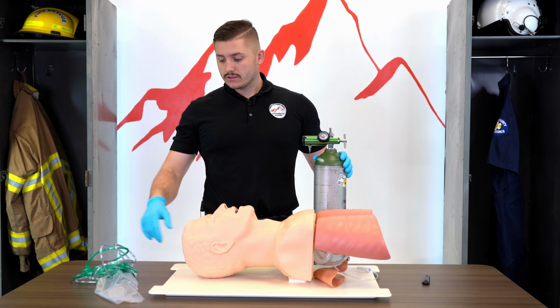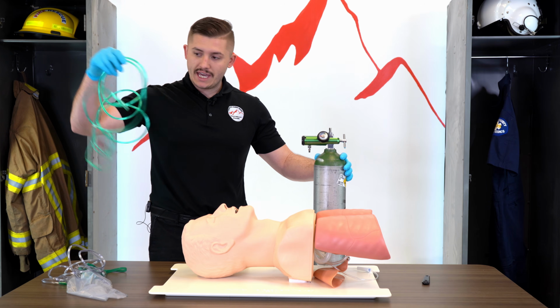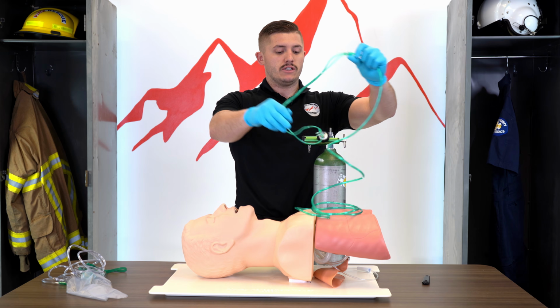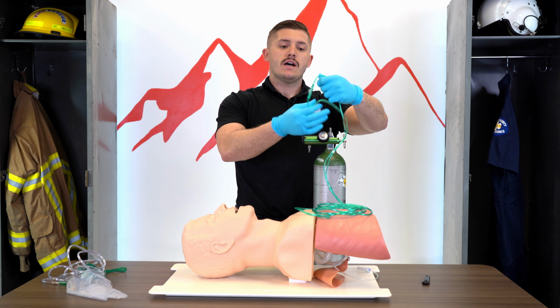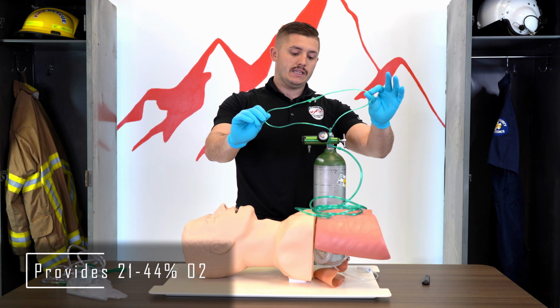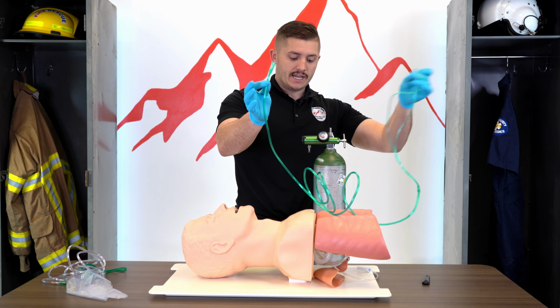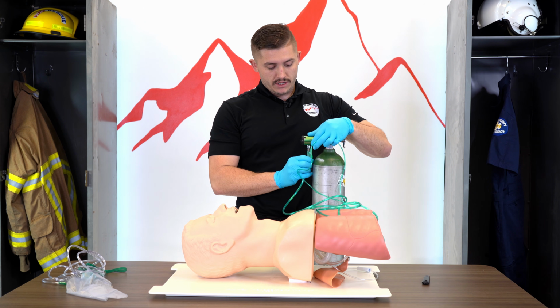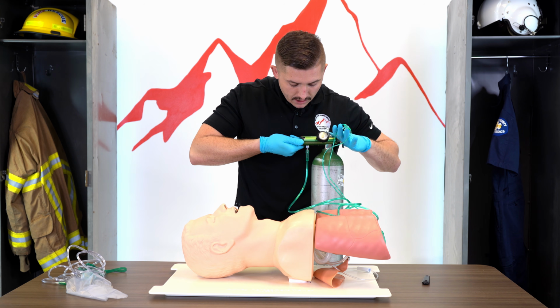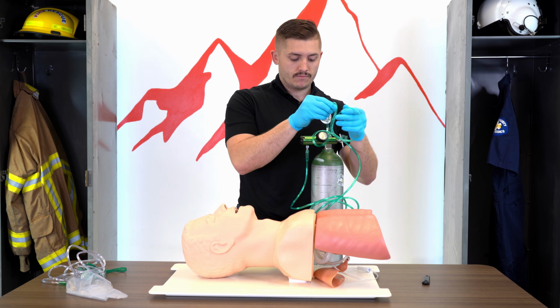Okay? So the least aggressive oxygen delivery device we have is going to be our nasal cannula. You probably see this on a lot of elderly patients, patients who just need a little bit of oxygen in their day-to-day life. Very easy to use. We typically flow this between 1 to 6 liters per minute of oxygen. So this will go in the patient's nose, and then we connect it to the oxygen right here. And if I want to put it at 4 liters per minute, I change it to 4, and then our patient can now inhale that oxygen.